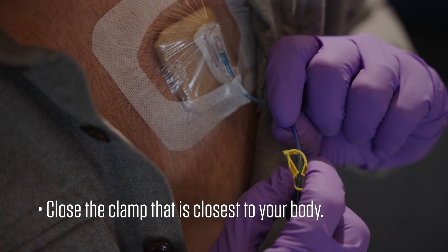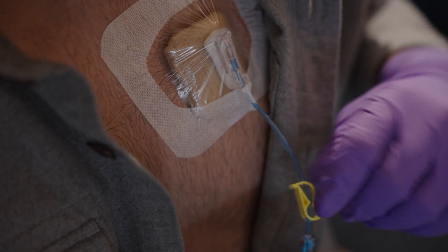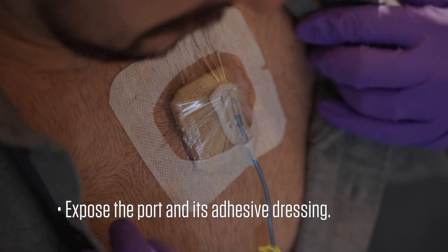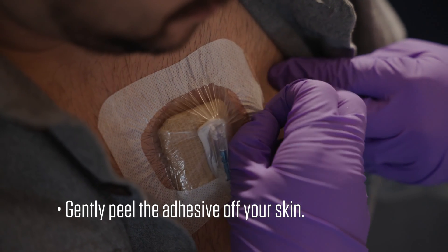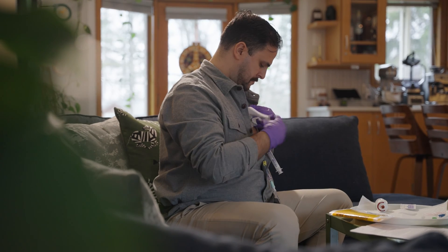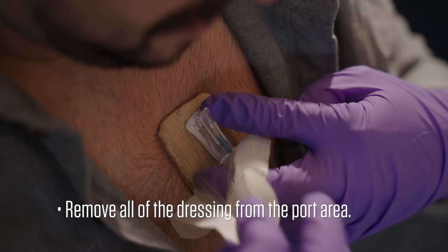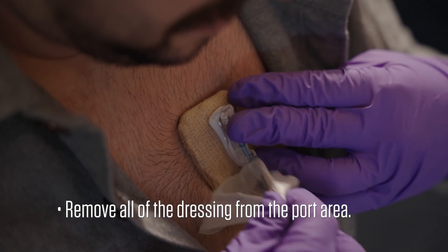Close the clamp that is closest to your body. Expose the port and its adhesive dressing. Gently peel the adhesive off your skin. Remove all of the dressing from the port area.